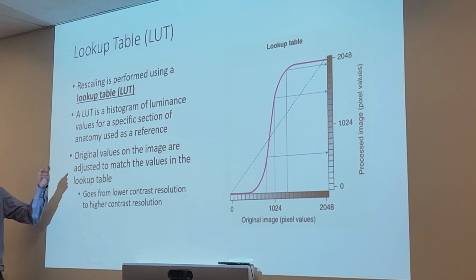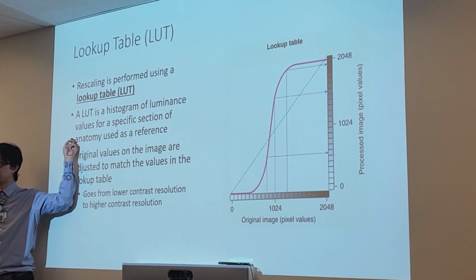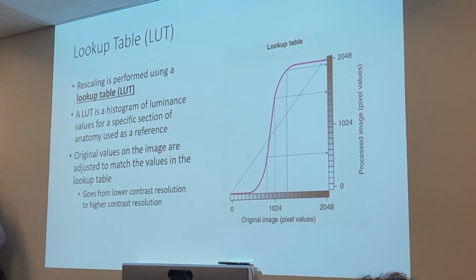Okay, and of course, this is per anatomy. So it is important that it is processed under the correct anatomy. So you're basically saying that when we click upper extremity, when we're dealing with CR in the clinics, it's setting it up, expecting that on the image.